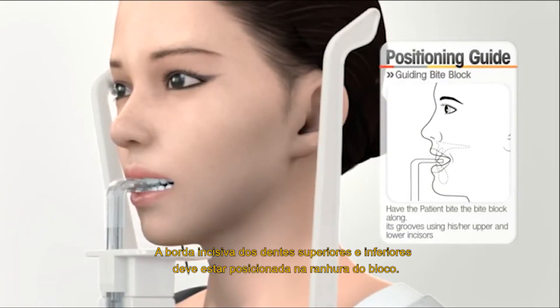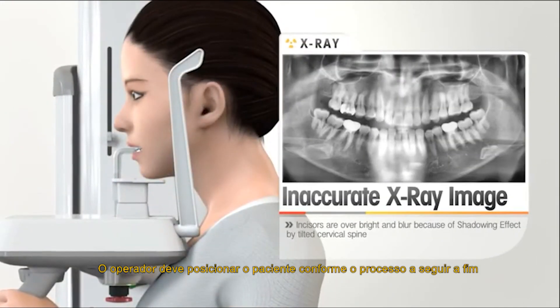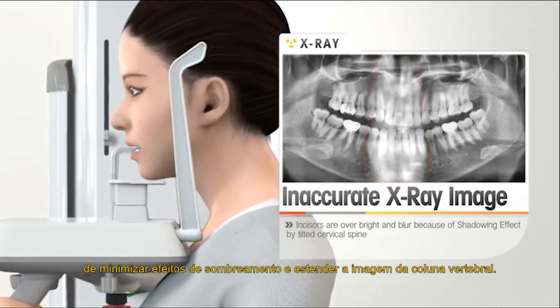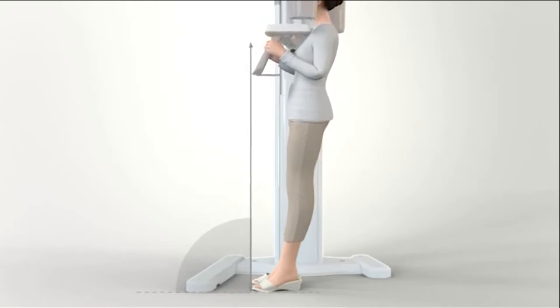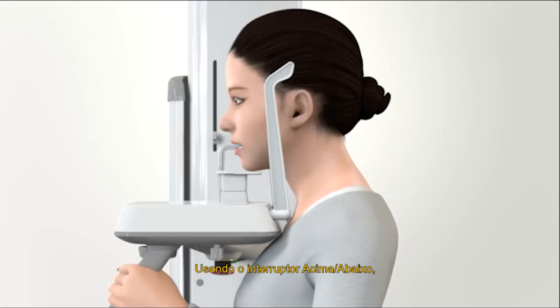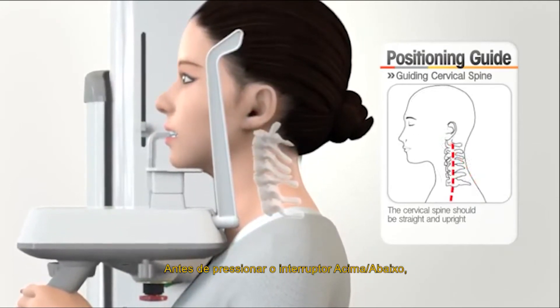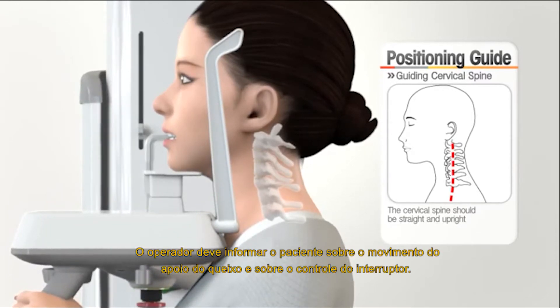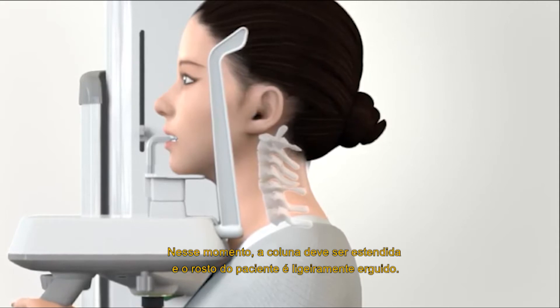The incisor edge of the upper and lower teeth must be placed on the groove of the bite block. Operator should position the patient according to the following process to minimize the shadowing effect of the spine and stretch the spinal image. Ask the patient to step forward, then bring the patient's chest close to the handle frame. Using the up-down switch, raise the chin support so that the patient's spine can be properly stretched. Before pressing the up-down switch, the operator should inform the patient about the movement of the chin rest. At this time, the patient should be stretched up and the patient's face raised slightly.